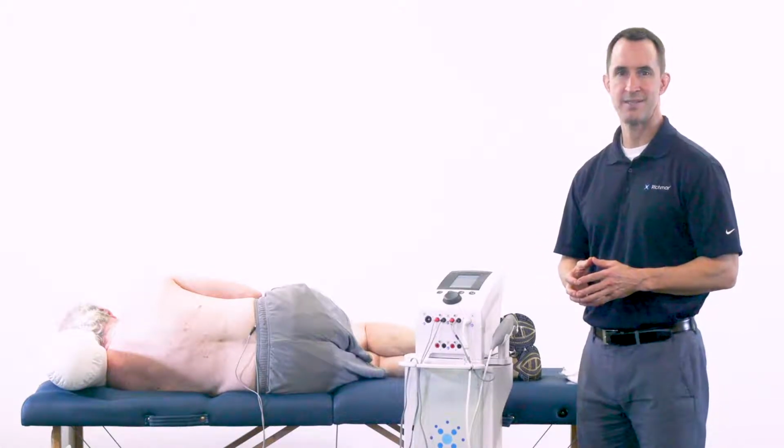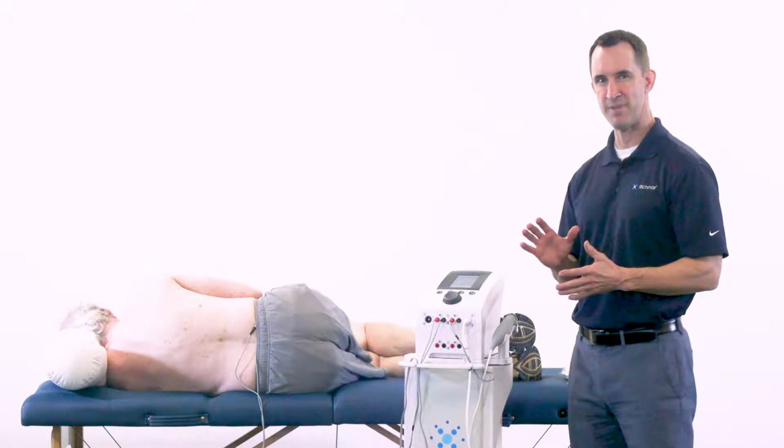some exercise programs. The clinical example for today is to facilitate the gluteus medius during a hip strengthening exercise, to be able to combine the modality of electrotherapy with an actual functional movement. Dosing intensity is important. We want to make sure that we produce a strong submaximal contraction to facilitate hip abduction.